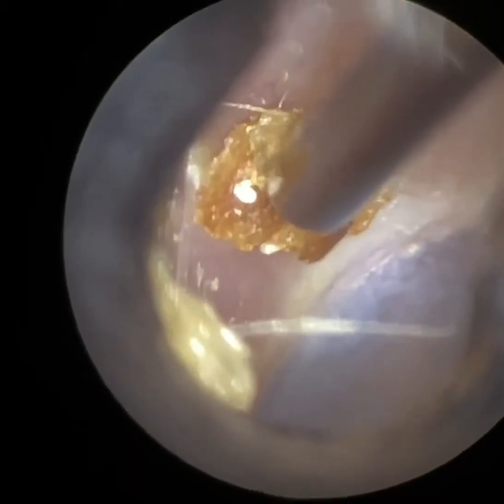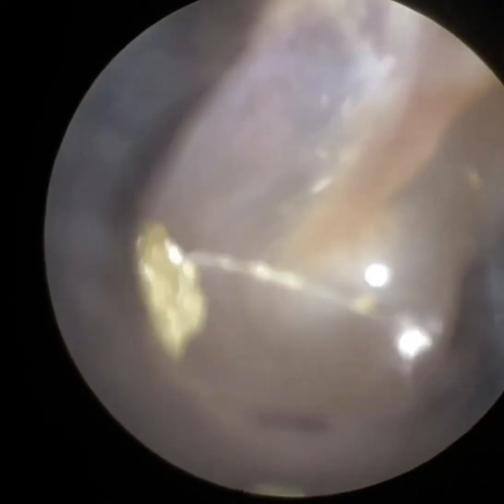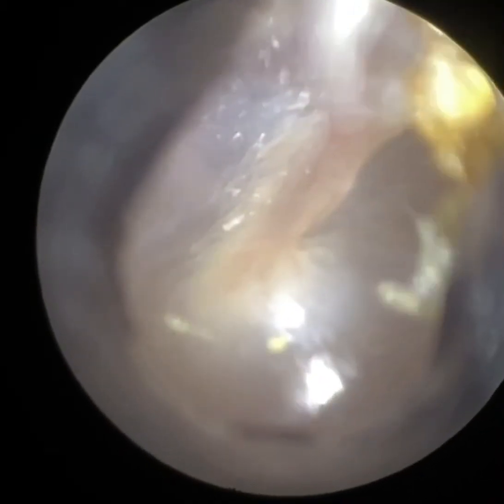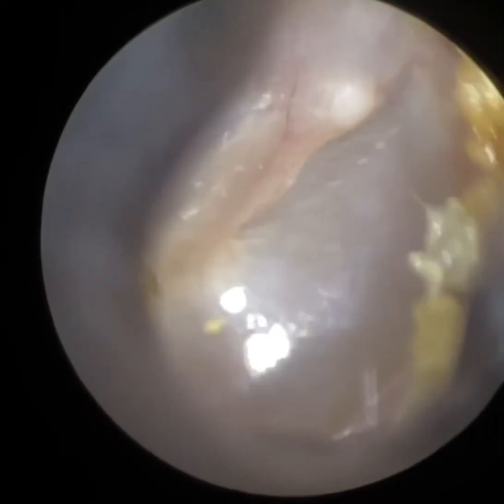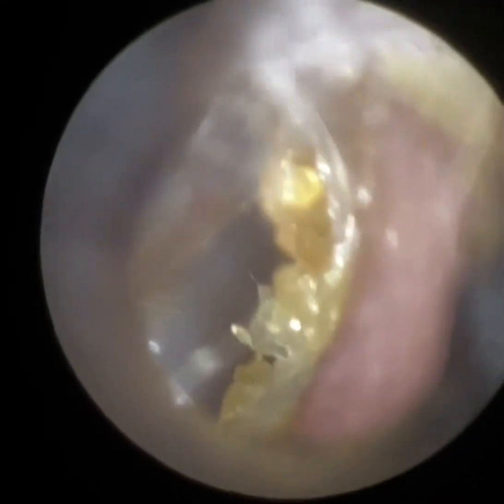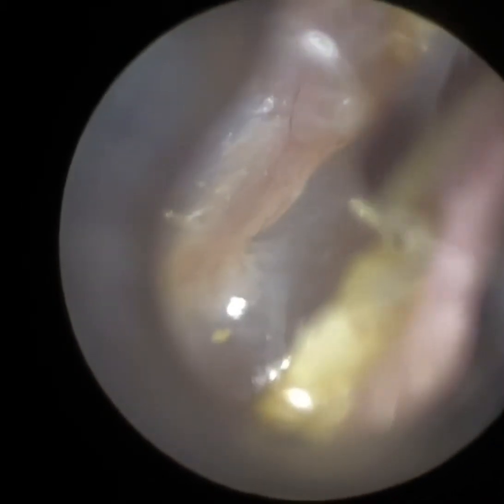This is some dry skin on the back part of the ear canal — quite medial. I'm just hovering over it. All of this is very deep, up against the eardrum on the latter third of the ear canal. We can see the eardrum already — it looks nice and healthy. You've got a lovely view there, very magnified. But it's just some keratin still that I'm going to peel away. I'm going to adjust the focus in a minute just to get this a bit clearer.